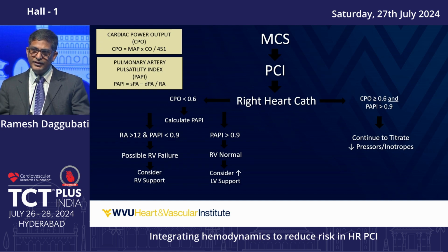Those patients have EF less than 35% and anterior wall MIs, and prior to revascularization, they can have an Impella placed or just standard of care, to see whether unloading of that patient is going to benefit anything.